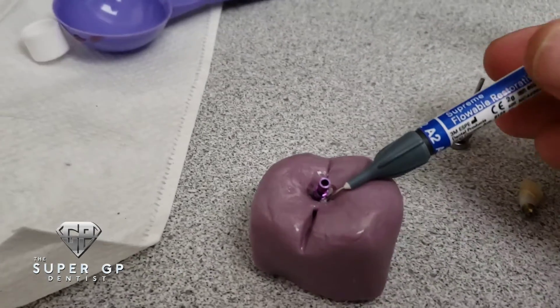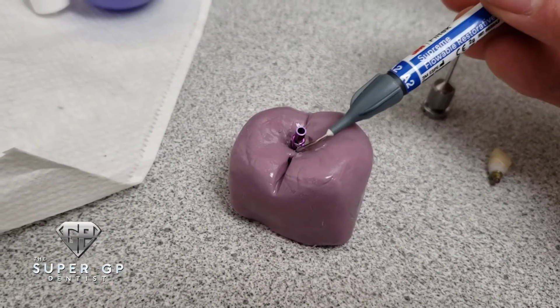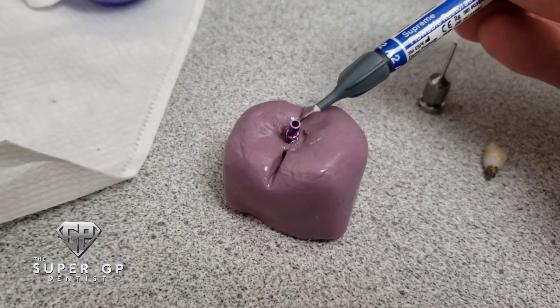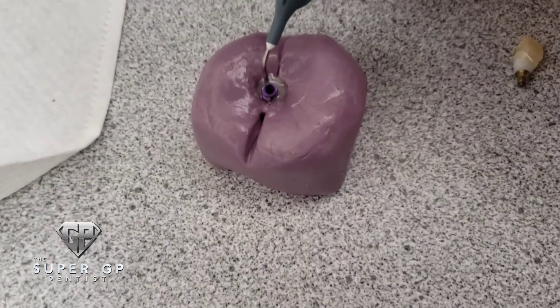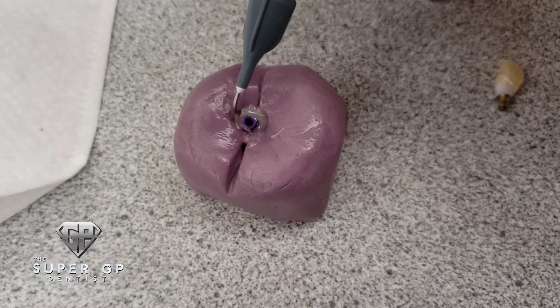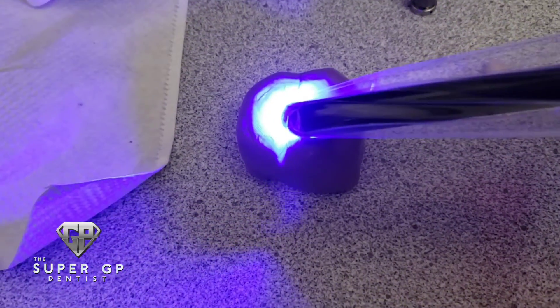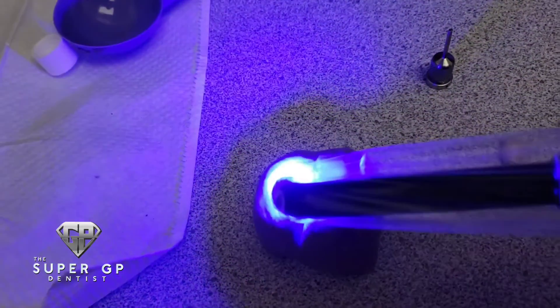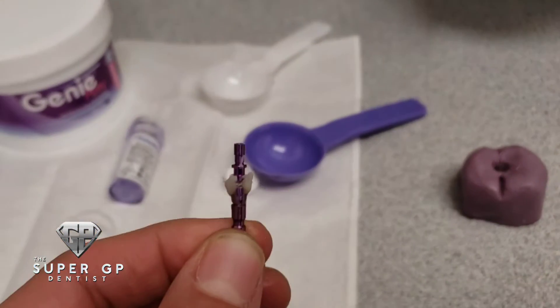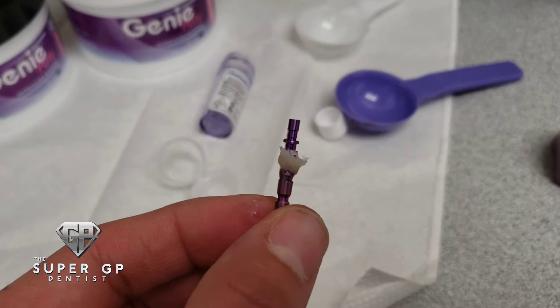Once that's set, add your material of choice. I usually use flowable — you can use any resin or acrylic that sets. I like what's fast and quick because the patient is in the chair, the soft tissue is collapsing, and you're fabricating this at the same time. I usually place a healing abutment to keep the soft tissue from collapsing. Place the material fully around the impression coping, cure everything with a nice deep cure — don't rush it or the material won't be fully set.